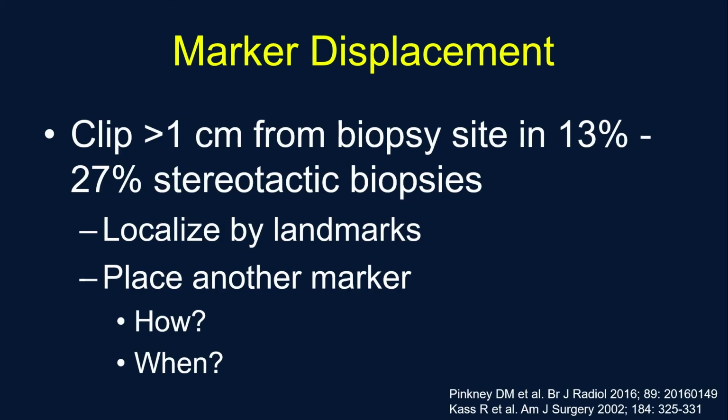But there are different things you can do. A recent study came out, and actually, we should not all feel too bad, because anywhere between 13 to 27% of the time, your clip is going to be off by over a centimeter. And you have several different options.